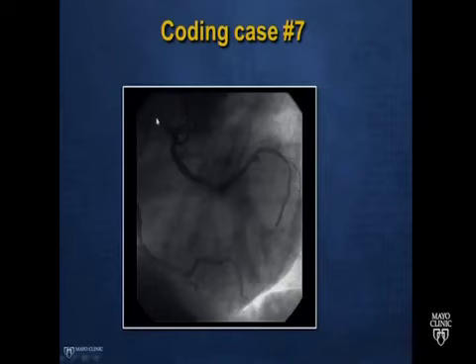If you wanted to code some atherosclerosis in the right coronary, I think you can. This is not a dedicated picture of the right, so I would not use this picture to code the degree of atherosclerosis, but certainly there is some here that is of indeterminate severity, at least at this point, I would say. So look for those stumps there.